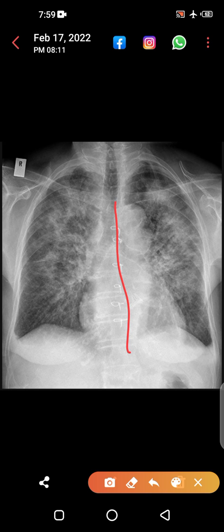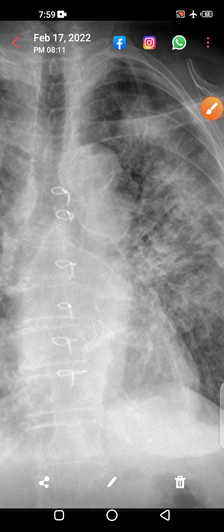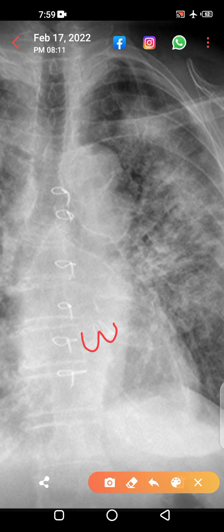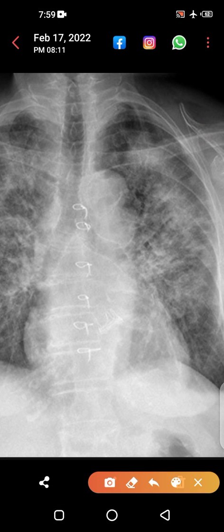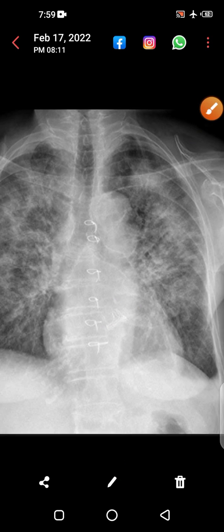If you focus on this X-ray image, you can see this metallic object — this is actually a metallic valve. So this patient underwent metallic valve replacement. These are the sternotomy wires from the open surgery, and the metallic valve has been replaced. You have to keep an eye on each and everything.